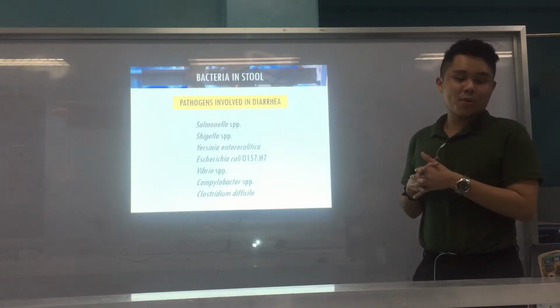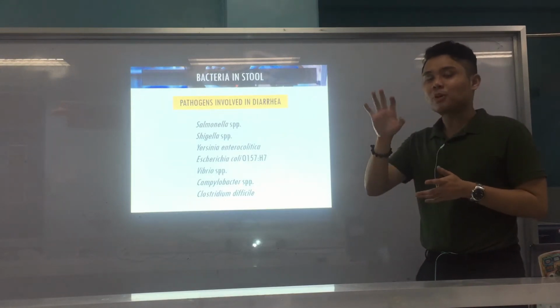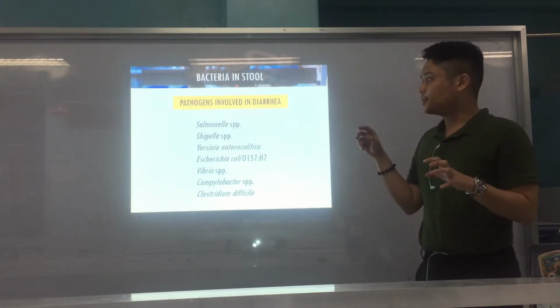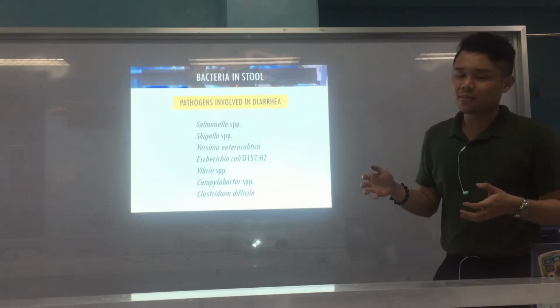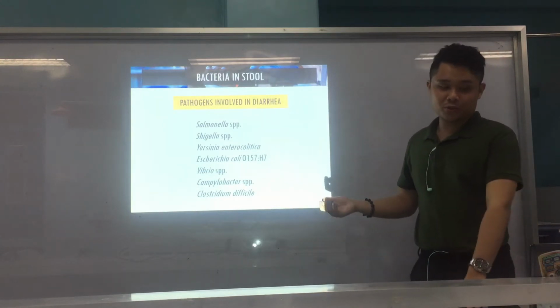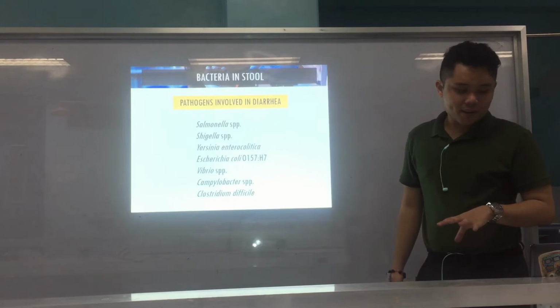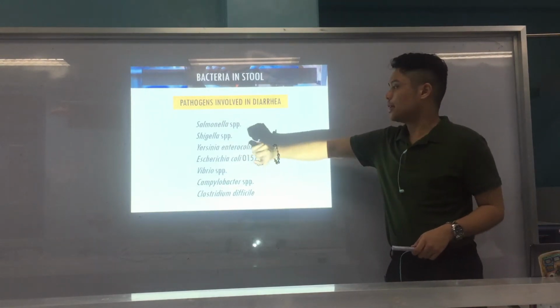So welcome now to part 2 of our lecture on stool culture. For this part, we'll go through the different pathogens that we may encounter in our stool specimen, in our stool culture results. We'll start first again with Salmonella until E. coli.